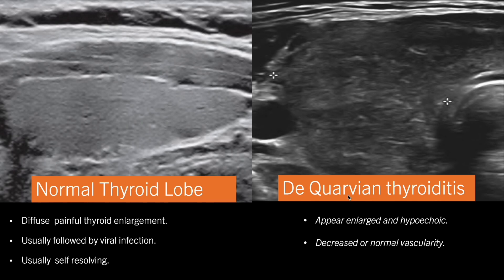Another important pathology is De Quervain's thyroiditis. As we know, De Quervain's thyroiditis is a painful condition in which the thyroid lobe is diffusely enlarged. It is generally followed by a viral infection, and in the majority of cases it will be self-resolving. On ultrasound, the thyroid gland will be enlarged and hypoechoic due to acute inflammation and edema.